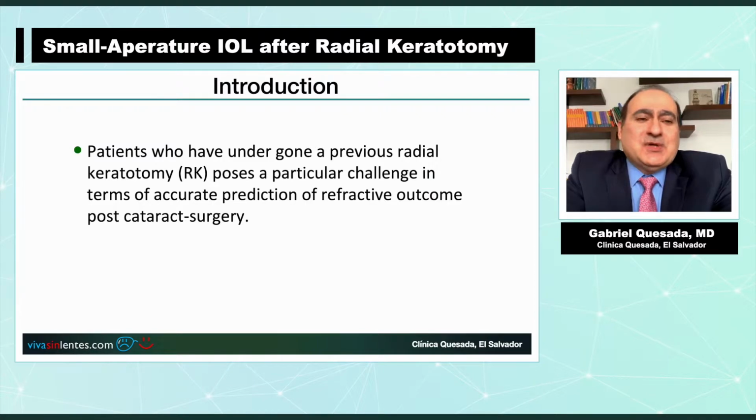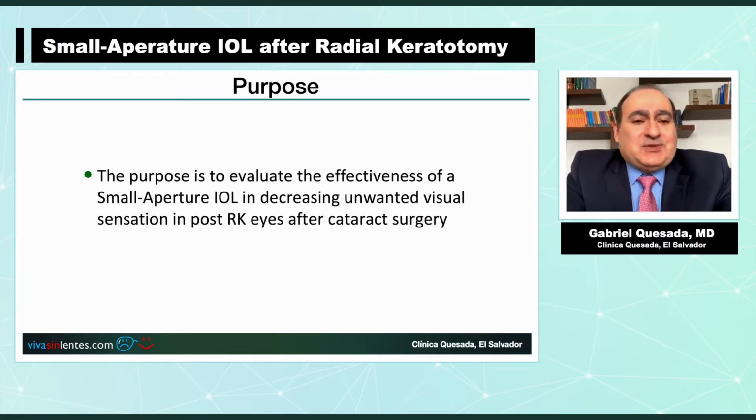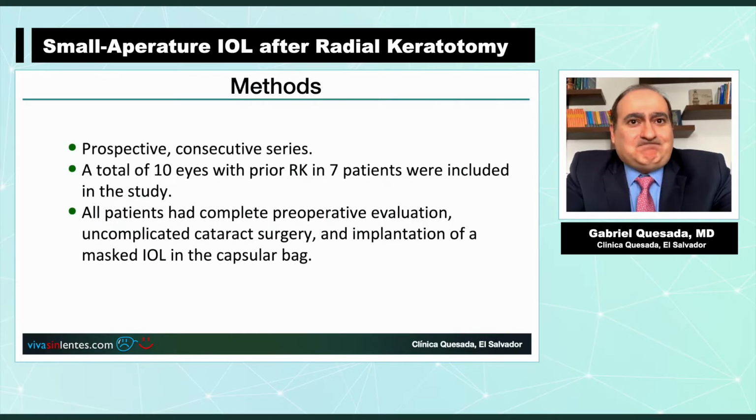As an introduction, we know that patients who have undergone a previous radial keratotomy pose a particular challenge in terms of accurate prediction of refractive outcomes post-cataract surgery. The purpose of this presentation is to evaluate the effectiveness of a small aperture IOL in decreasing unwanted visual sensations in post-RK eyes after cataract surgery.